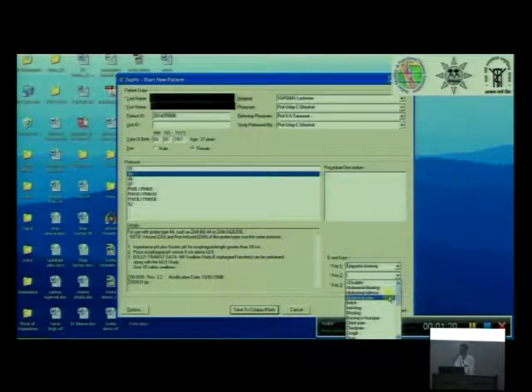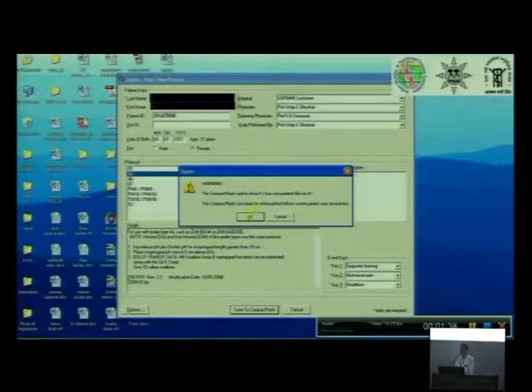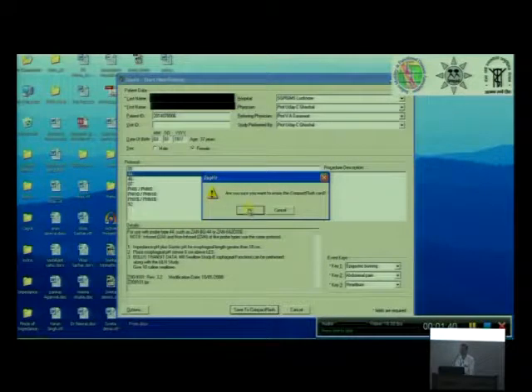Now on the right hand side you select the keys. Why these keys are selected I will tell you. During the procedure, if the patient has epigastric pain, we will instruct her to press key number 1, because in the system we have fed key number 1 to mean epigastric pain. All this is being done in a chip. The chip we remove from the pH meter or data logger and put into the computer where the software is there, and then you are doing all this. Key 3 is heartburn.